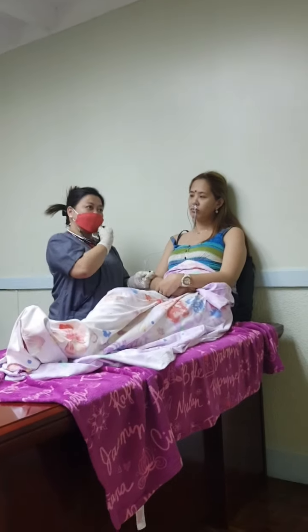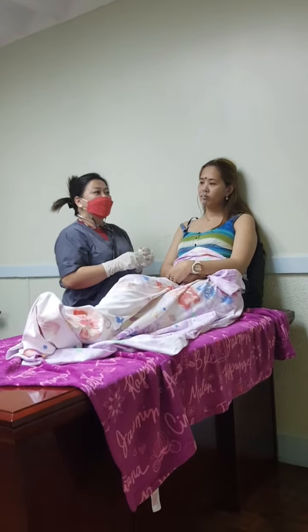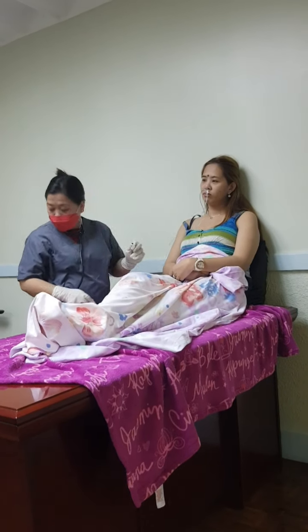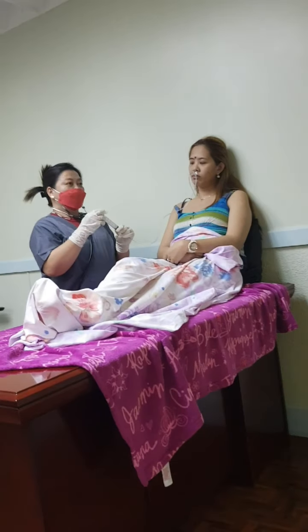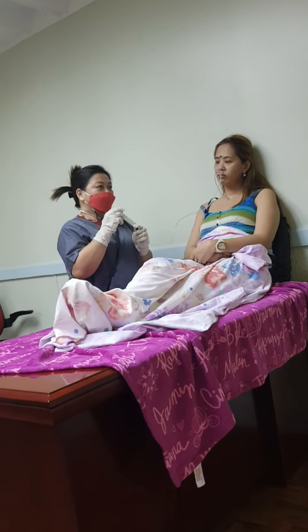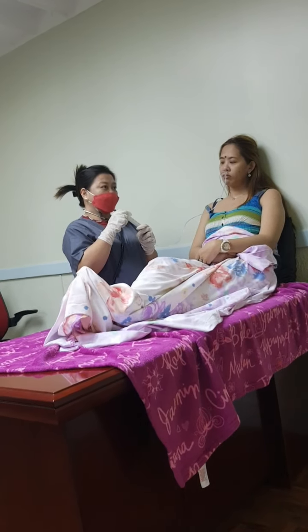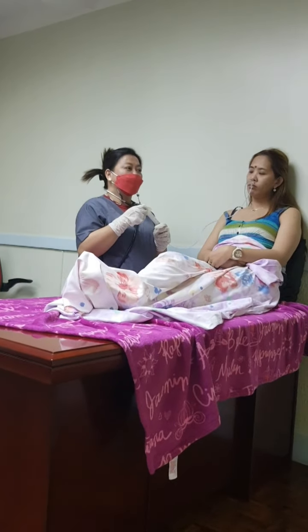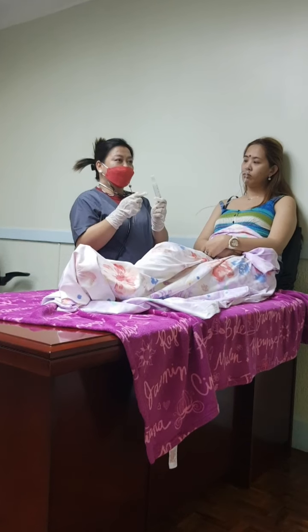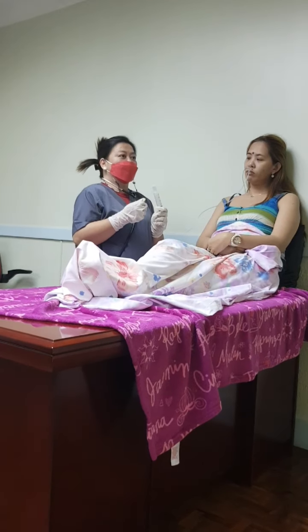Aspiration of a small amount of stomach contents. Attach the syringe to the end of the tube and aspirate a small amount of stomach contents. Visually check the aspirated contents for color and consistency. The tube is in the stomach if its contents can be aspirated.